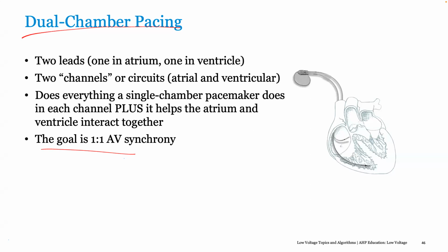Because not all electrophysiology support that, but I know many centers on your side may be supporting that by not putting a lead in the atrium. And if that happens, what do you do? Because these are patients who have heart failure.